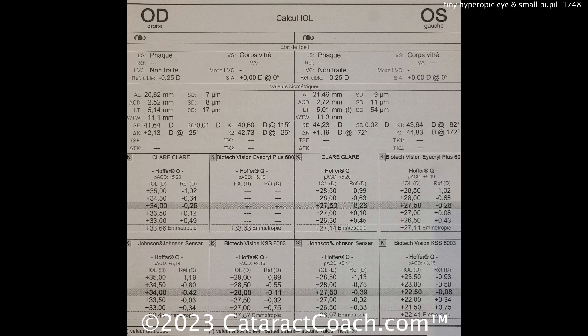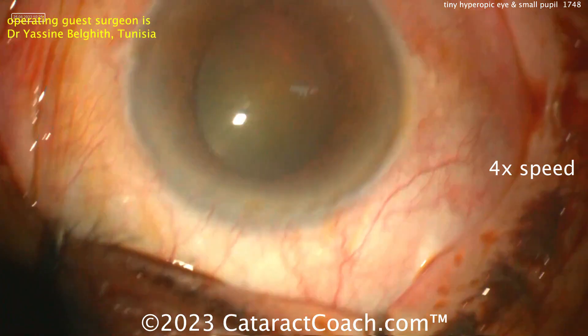Looking at the calculations: the right eye is 20.6 millimeters, the left eye 21.4 millimeters. This means the right eye is more hyperopic, calling for a 34-diopter lens, and the left eye calling for a 27.5-diopter lens. This patient has a high degree of anisometropia, which probably also means amblyopia in this right eye.